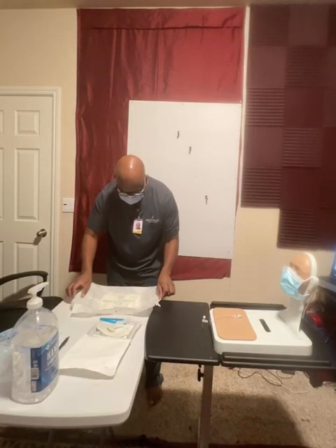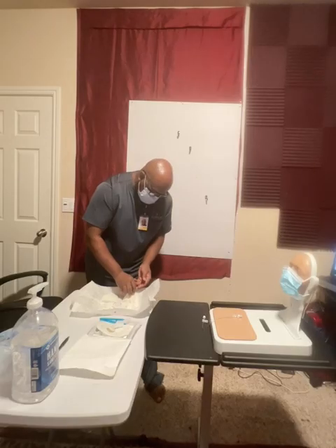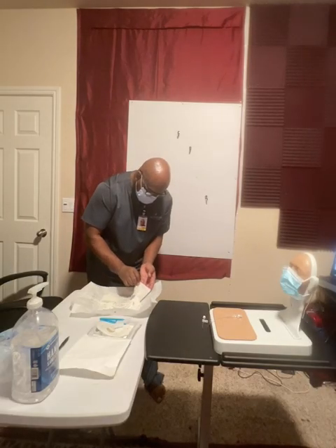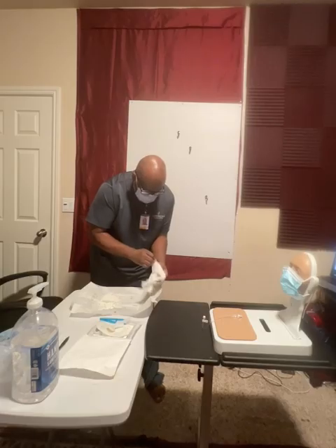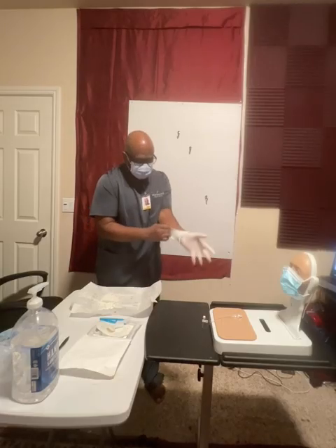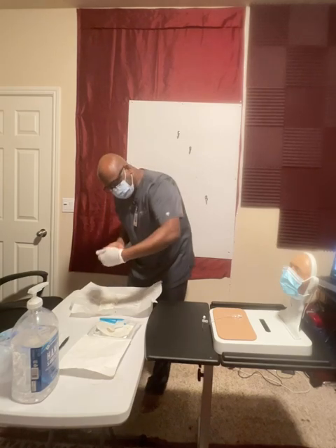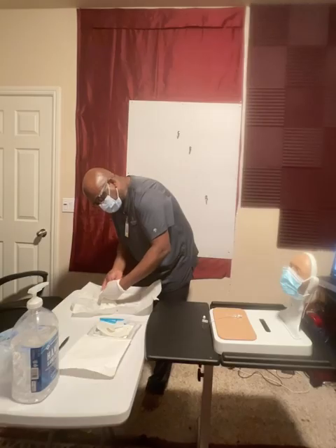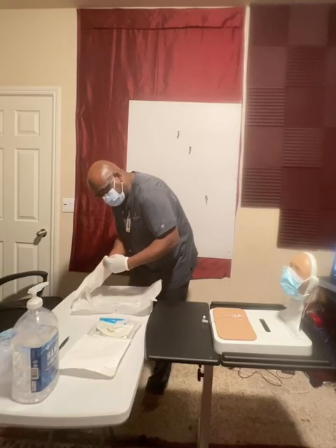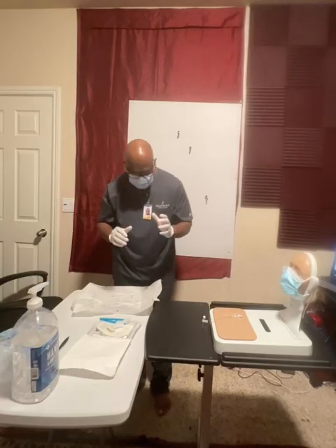Okay. Now, I'm going to put the glove on my non-dominant hand first. I'm going to just grab the edge of the glove. Okay. I want to make sure we always find that thumb. That's always the hard part. The thumb and the pinky. That one's in. Now I'm going to use the cuff technique. I'm going to cuff with my non-dominant hand and cuff the actual glove here. Slide that on.